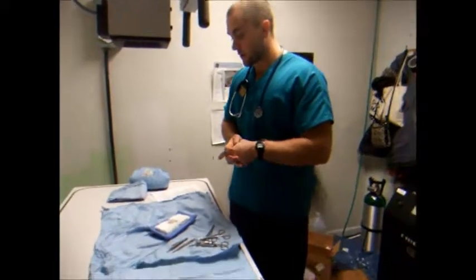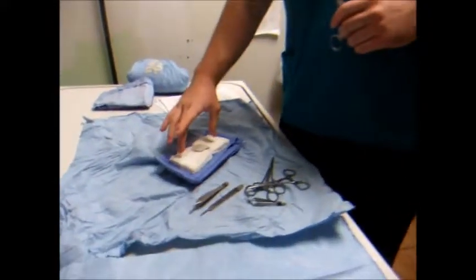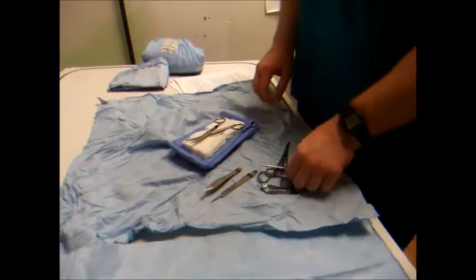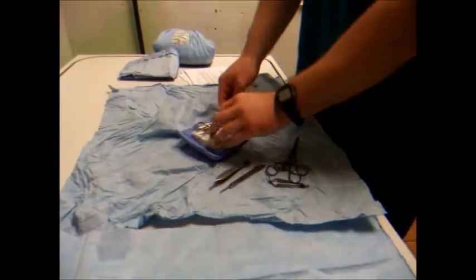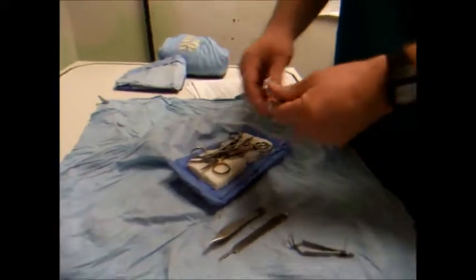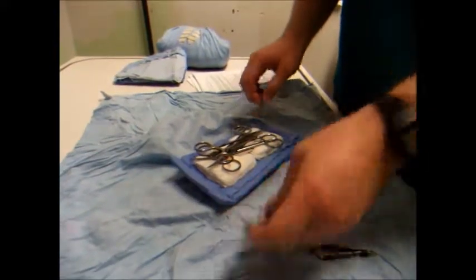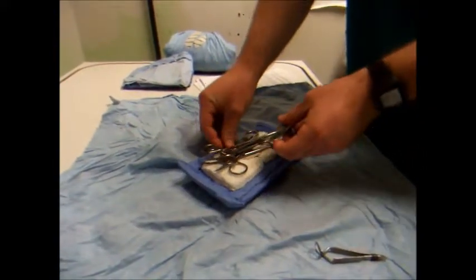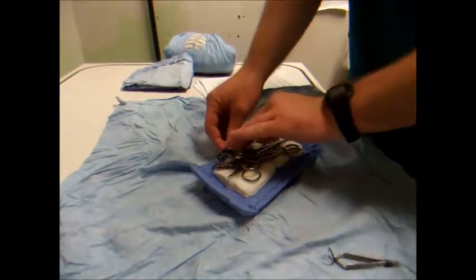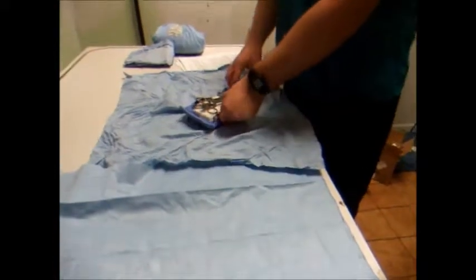I'm going to go ahead and pack. This is a neuter pack. So we started off with the towel. We've got our gauze, our needle and our needle holder. We've got scissors. We've got our needle holder. These bad boys. We'll put these right on the side. We're going to put these right on the side also.